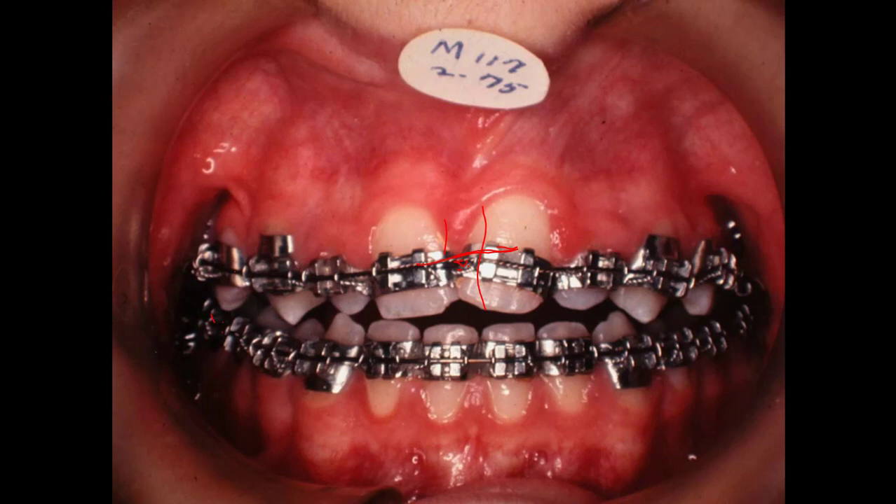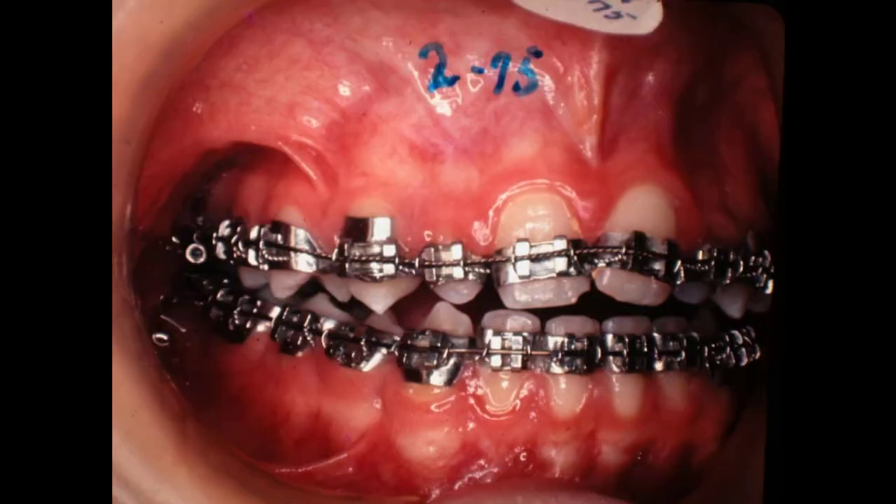We got the upper teeth over so that the cusps weren't meeting on top of each other, and the bite closes down as we go. We get the young lady breathing correctly — she can certainly breathe a lot better. This is the increase in the airway when you do this. Just a lot of benefits happen from a palatal separator — it's one of my favorite tools to use in orthodontics, and we've done an awful lot with them.